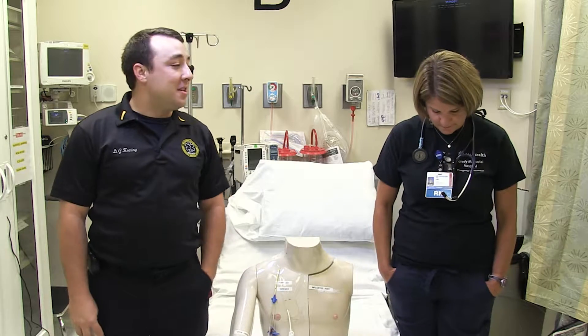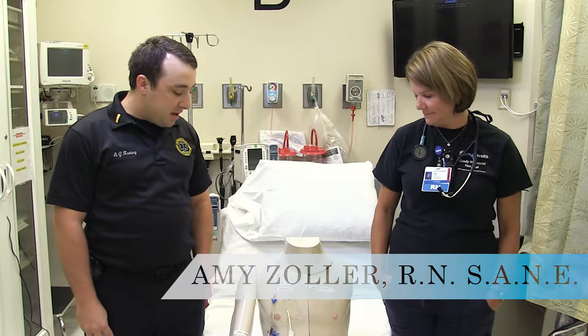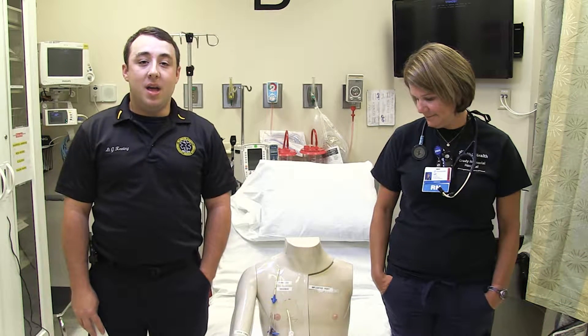Hi there, I'm Glenn Keating, host of the ENCODE and clinical educator here at Delaware County EMS. We're at Ohio Health Grady Medical Center, or Grady Memorial Hospital, here in Delaware, and I'm joined by registered nurse in the ER, Amy Zoller, who's also a SANE nurse, and is going to teach us about a unique protocol within our patient care guidelines that talks about accessing implanted and existing central catheters.